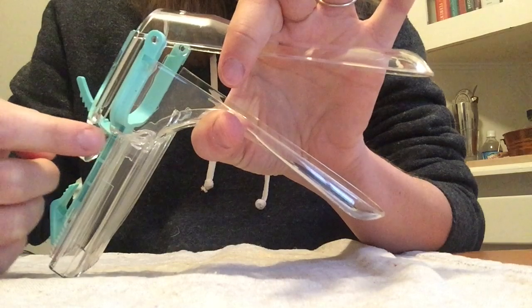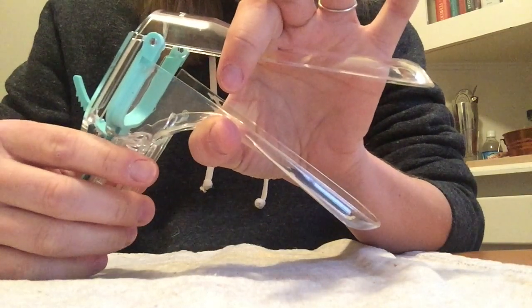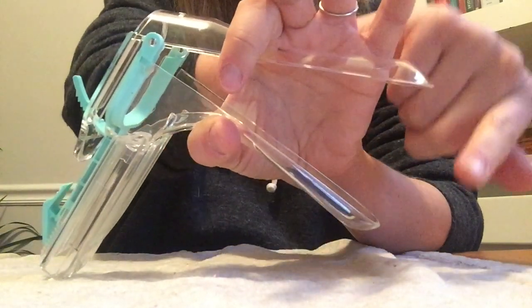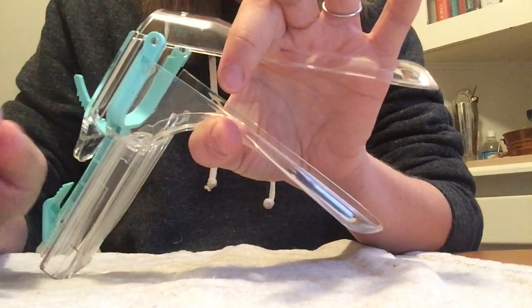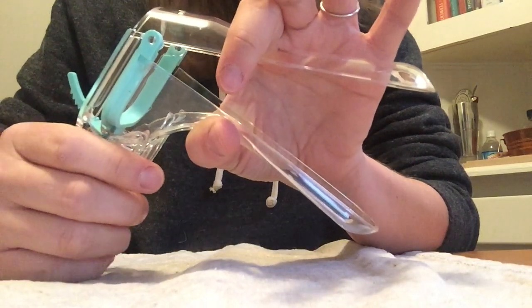So with the speculum open, your care provider can now see your vaginal walls as well as your cervix, which will be right down here on this side. And if you need a pap test, that's what they'll swab the cells on your cervix to send into the lab.